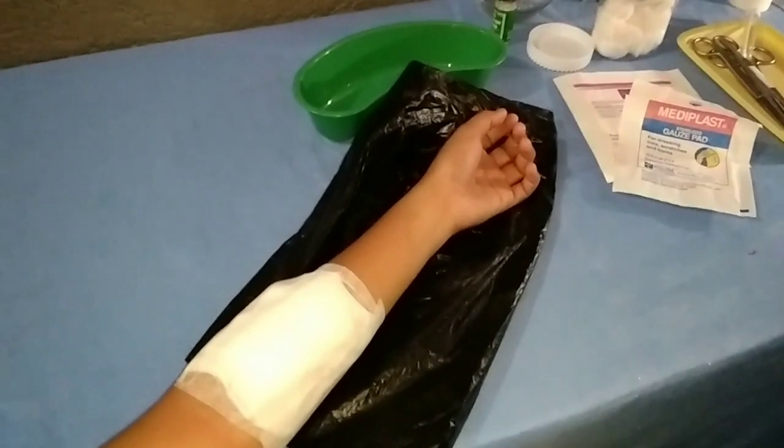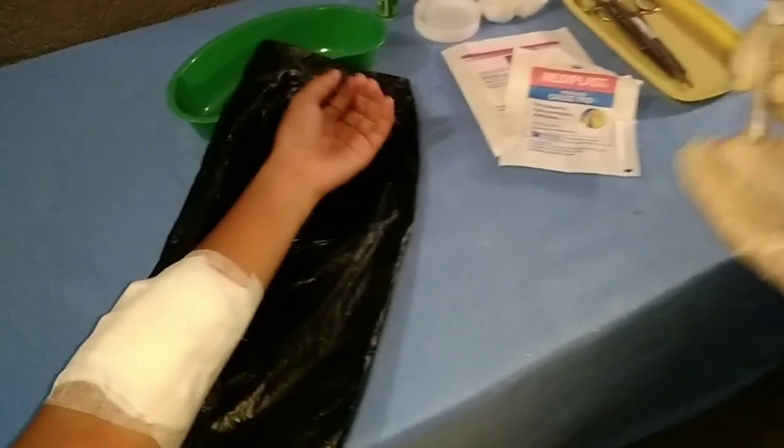Okay, and then after that, arrange for the specimen to be transported to the laboratory immediately. Be sure to include the completed requisition.